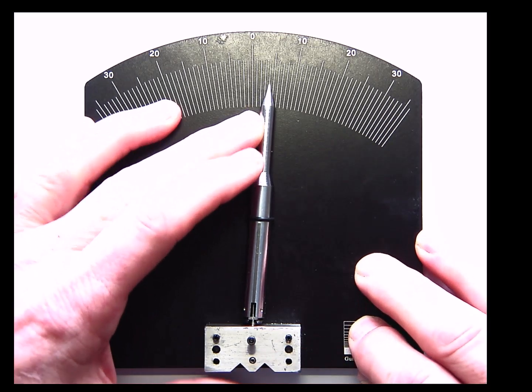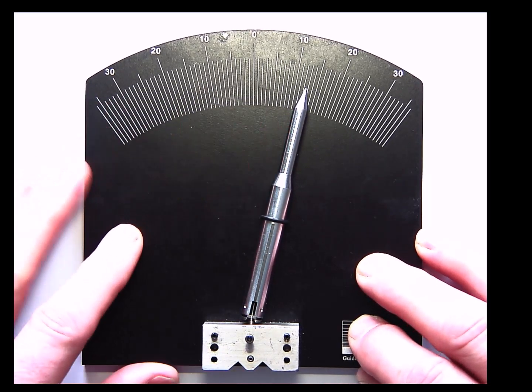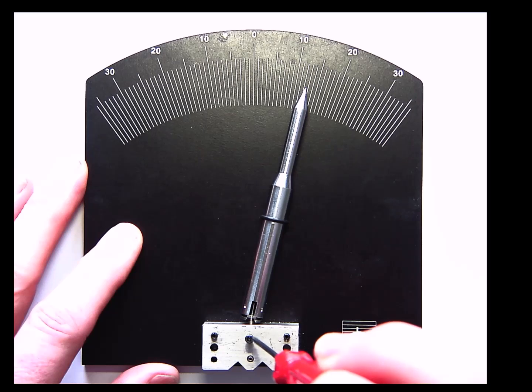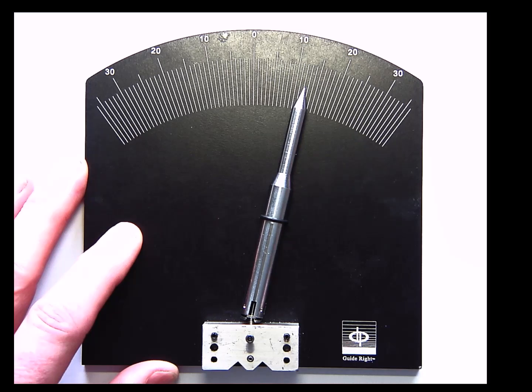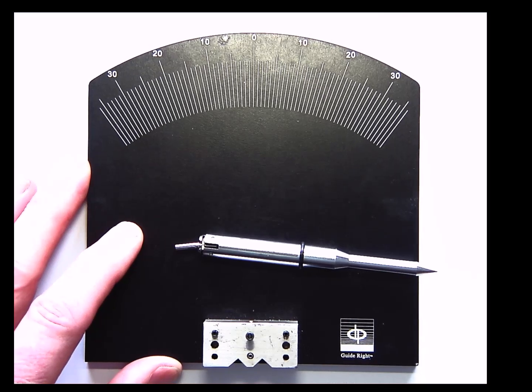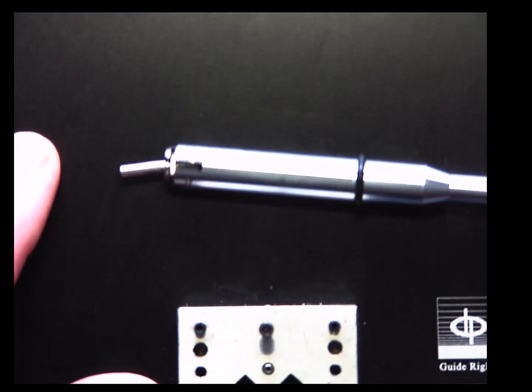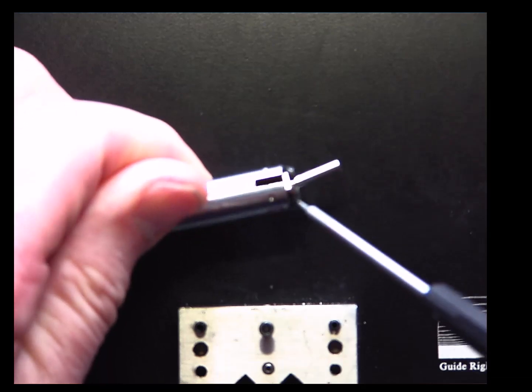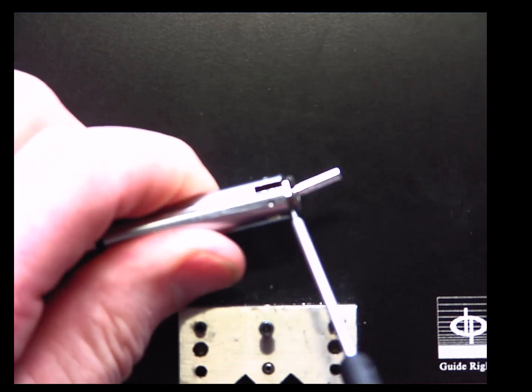The 12-degree correction is made with finger pressure by bending the stylus to the 12-degree mark. The cap screw is loosened to release the stylus and the corrected guidepost. To release the corrected guidepost from the stylus, the set screws are loosened with a 0.035 hex driver.